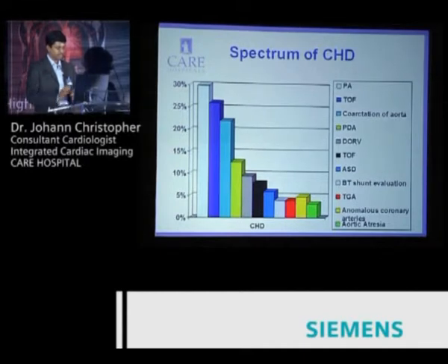And this seems to be the largest group, which in echocardiography has a significant limitation to delineate the pulmonary arteries, to delineate the feeder vessels, to delineate the MAPCAs. The second group are the complex tetralogies with or without associated lesions, and also with very small pulmonary arteries, which are again very difficult to delineate. And the biggest takers of our program are not our cardiology group, but the cardiac surgeons, who are very, very happy with the images. The third largest group are the aortic studies, coarctation and complex coarcts with or without a PDA with the VSD. And MR can do a great job delineating this.